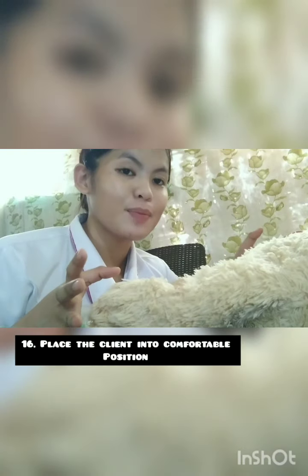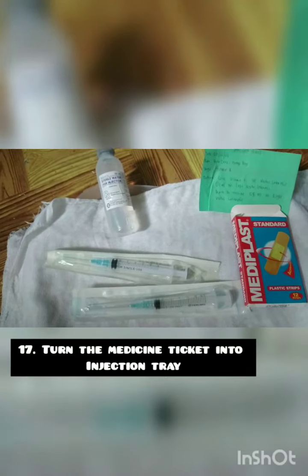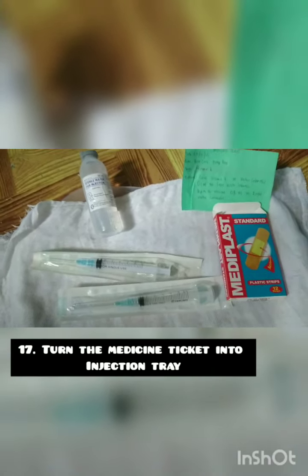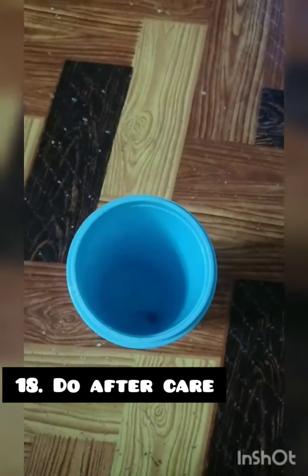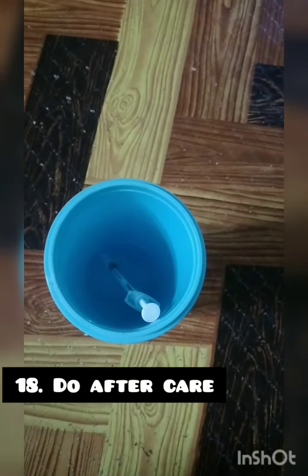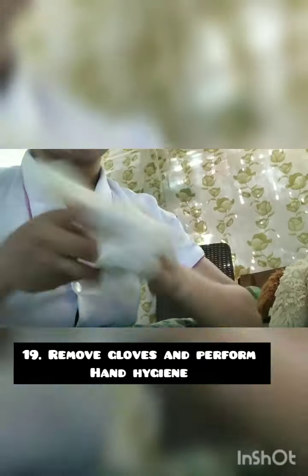After that, help the infant to be in a comfortable position. Turn the medication ticket to the injection tray upside down. Do aftercare by discarding the used needle into a puncture and leak-proof receptacle. Remove gloves and perform hand hygiene.